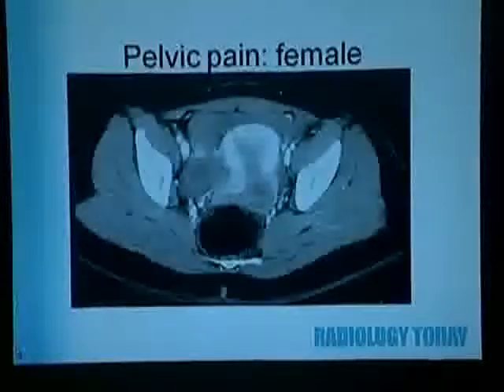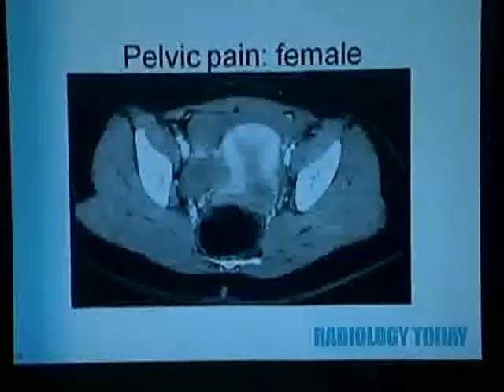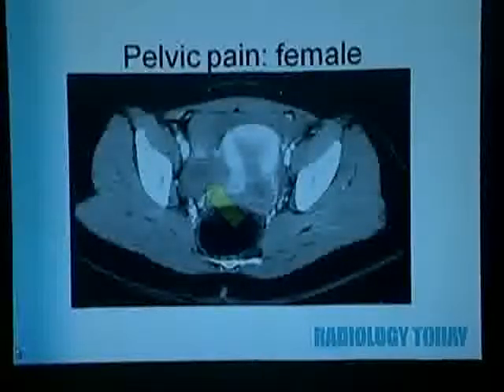However, this woman has a lot of hemoperitoneum, this high-density free fluid within the abdomen. Women can have a small amount of pelvic fluid, but this is way too much. It's up by the liver, you can see, and the spleen as well. Now, down in the pelvis, she's got this small peripherally hyperdense and centrally low-density mass within the right adnexa.